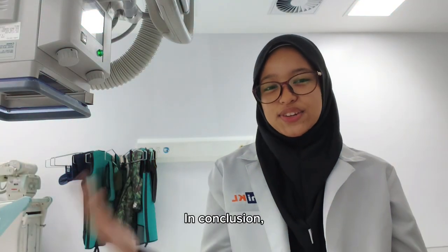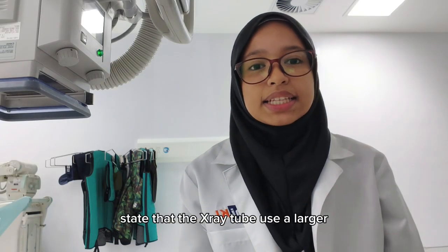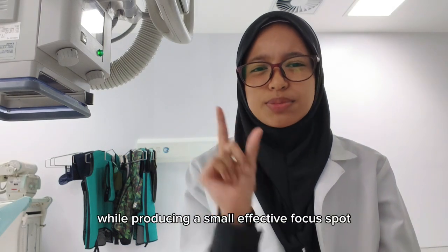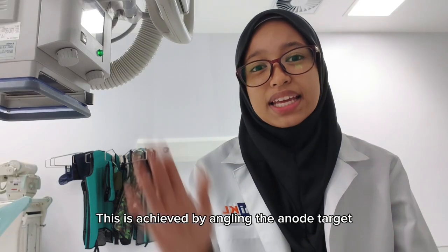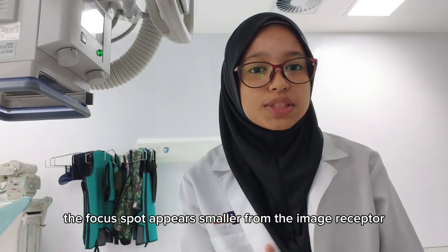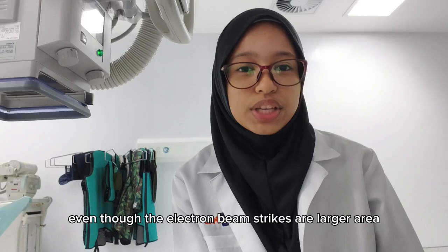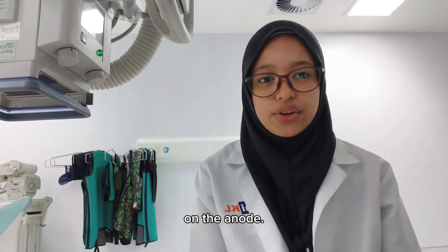So, in conclusion, the line focus principle states that the X-ray tube uses a larger actual focus spot to tolerate heat, while producing a small effective focus spot to improve image sharpness. This is achieved by angling the anode target. Because of the angle, the focus spot appears smaller from the image receptor, even though the electron beam strikes a larger area on the anode.